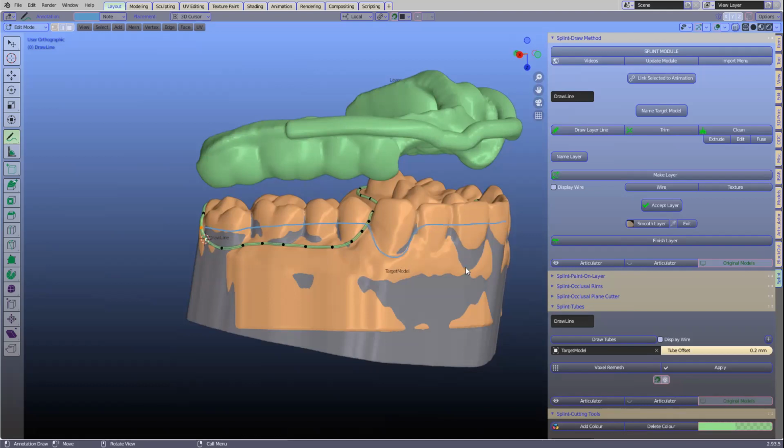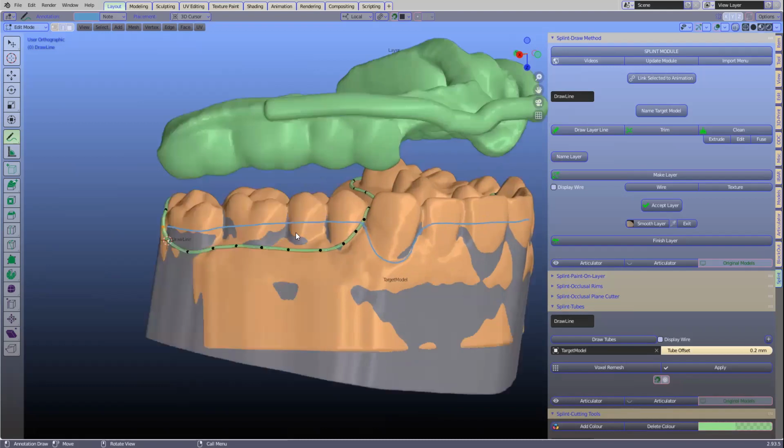To me, sorry, it makes... Wolfgang, we've been in the lab business for many, many years, and we hate remakes, don't we? So when a dentist calls us up and says, look, this patient's come back to me, the splint always comes out of the mouth, we cringe, don't we? Because we have to remake it free of charge. So we've become intuitive, and with these Michigan splints, we put a ball attachment over the top here to keep a splint like that in the mouth. Is that correct? Yeah, that's correct.